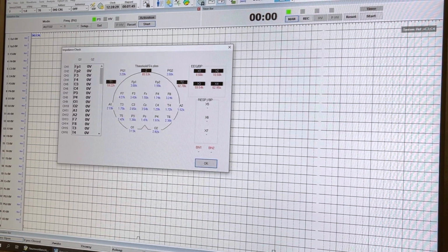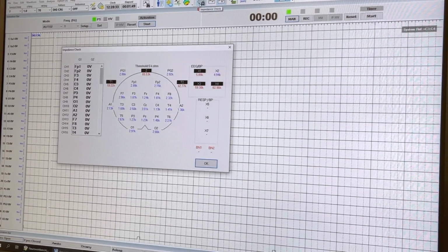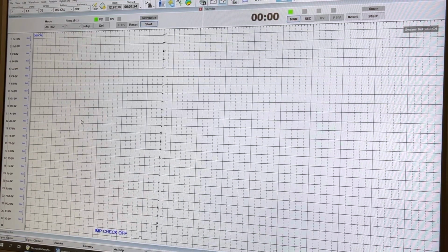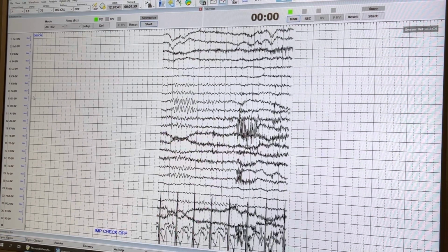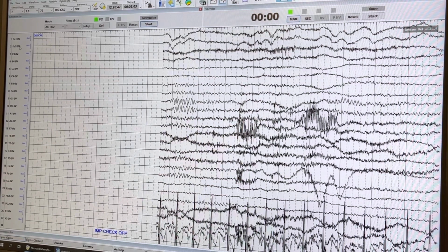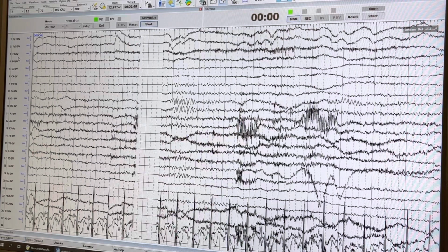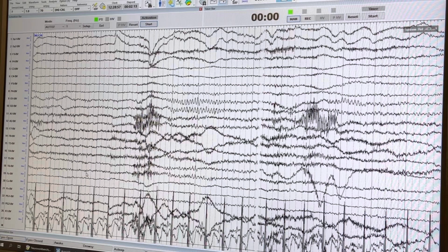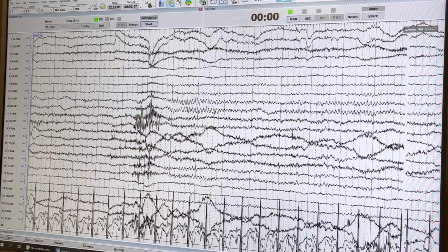Okay, so again, the impedance meter is right here. This is the impedance one. It has the ohm symbol on it right here. So when you're done, just click it off. And here's the DigiCal. It lines up each analogous pair of electrodes going down, like FP1 over FP2. I think we're going to change our BioCal into a DigiCal, but I'll talk more about that later. But these are all the electrodes on the head.